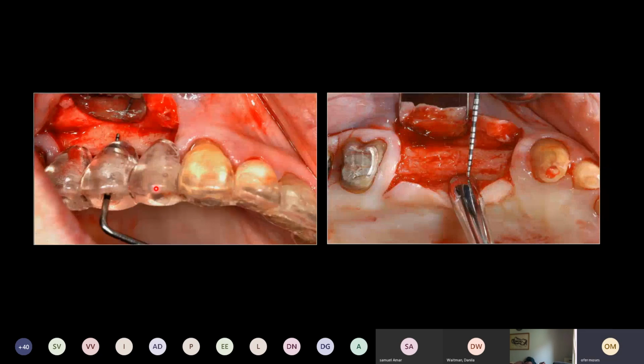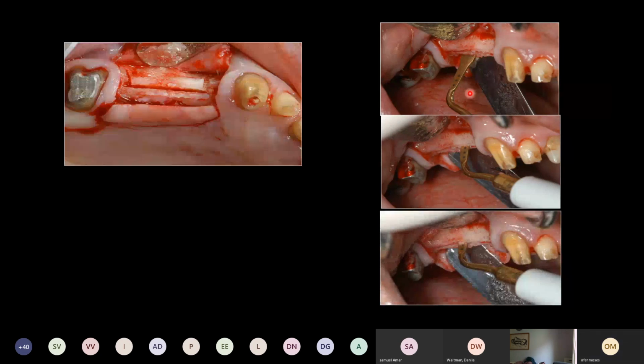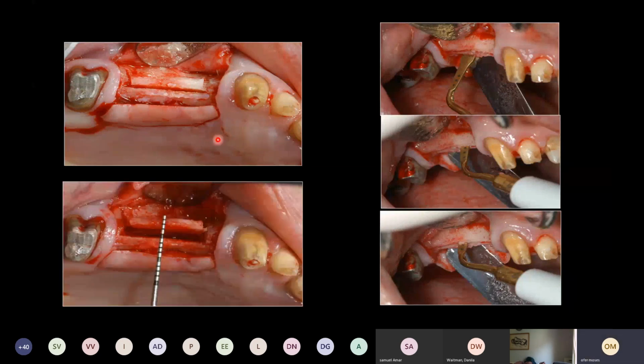By the way, this is the surgical guide. Here you can see the distance between the center of the needed implant. It is outside of the bone envelope. So we have to bring the center more buccally. So we split the ridge with a piezo surgery knife. You see the ridge with the two verticals. After pushing aside with the chisel, this is the before and this is the after.